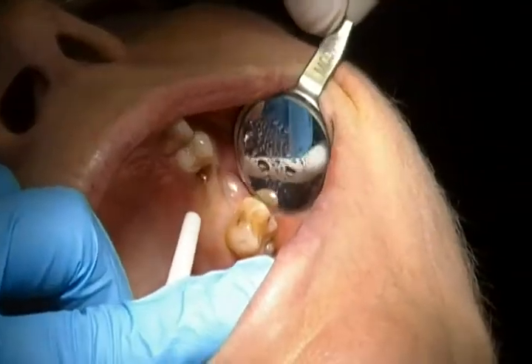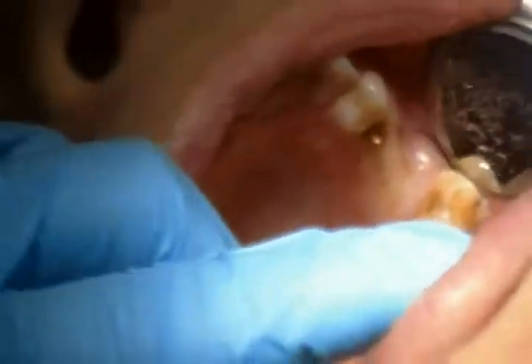Open it. And there's the implant. You can strap. Okay.